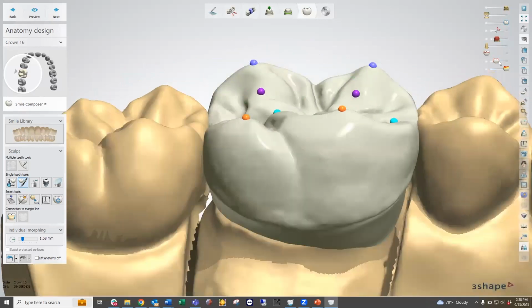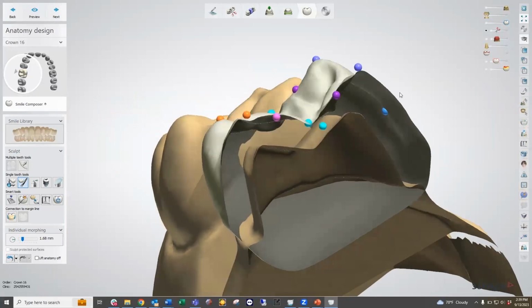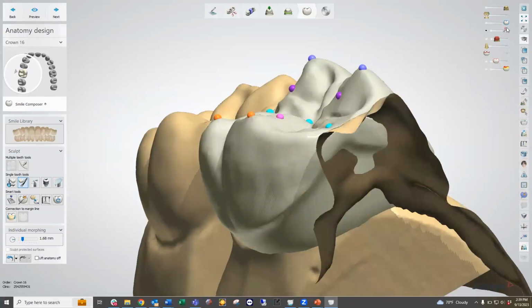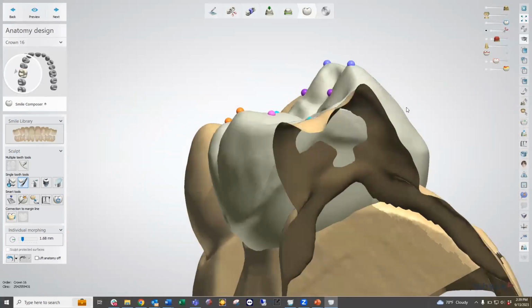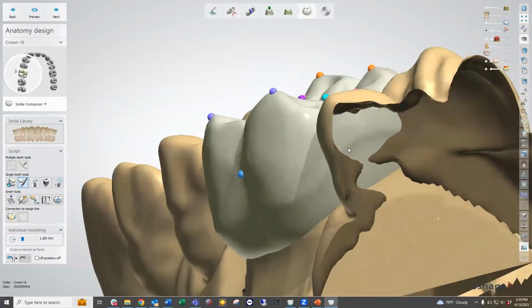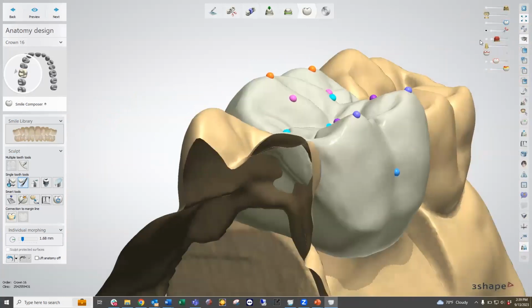So next, what we have is, along with our visual sliders, we have our current model, which is our operative model, or the segmentation arch. We also have our active item, which is our current unit that we're working on. And then we have our clip plane, which allows us to kind of cut through the model and see exactly where our unit is looking. We can change that plane by hovering this around, and we're going to use that a little bit later. So basically cuts our model and allows us to kind of view in those interproximal areas.